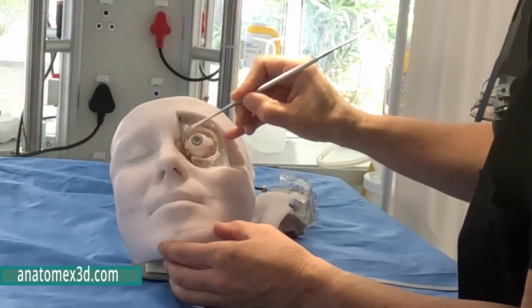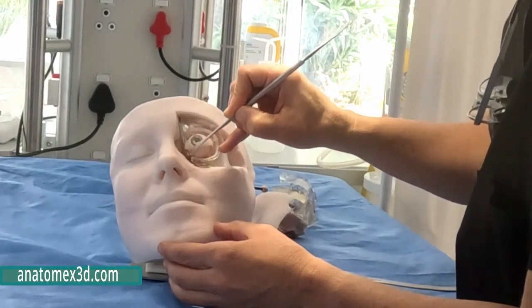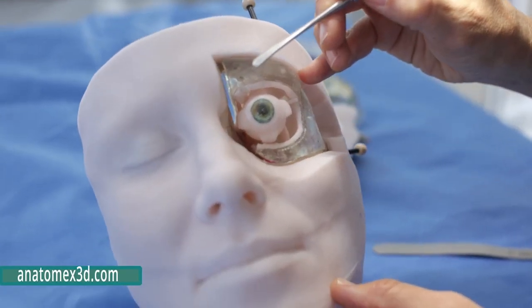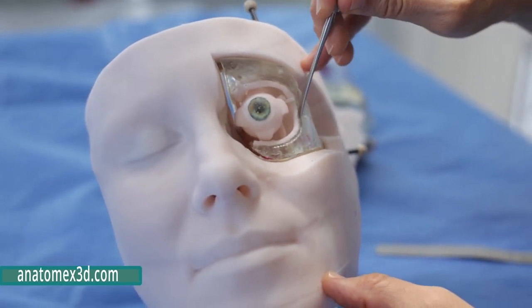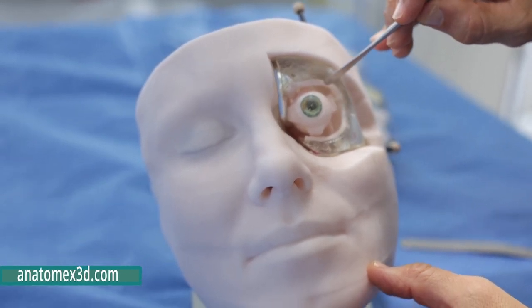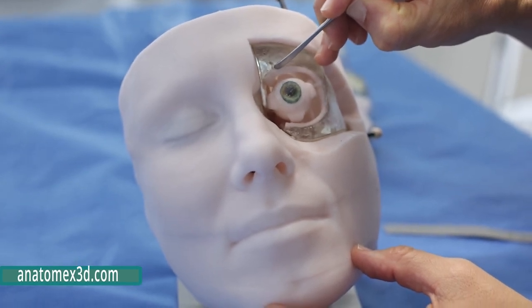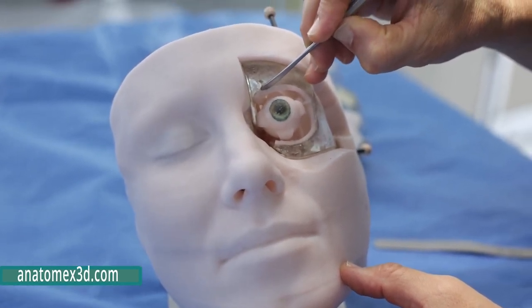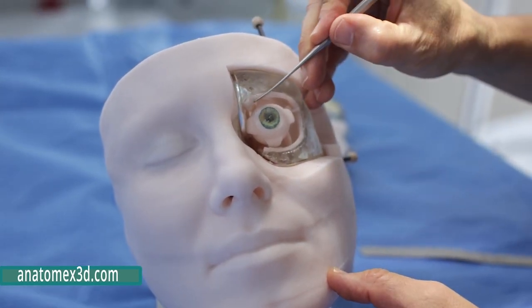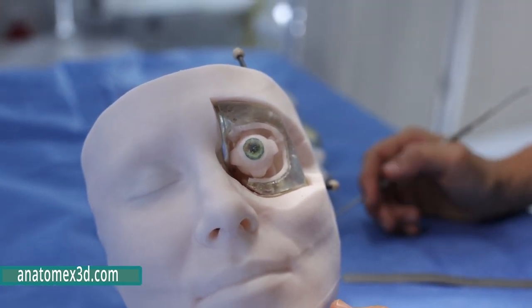And that's really important for people to understand, that when we look at the medial corridor, we work between the trochlea and this area at the bottom where your inferior oblique attaches. So there's no real risk of injuring structures if we remain in a subperiosteal plane, because even at the level of the trochlea, if we dissect the tissue off and remain in the subperiosteal plane, we will dislocate the trochlea where it attaches to the periosteum, to the bone, and as long as you place that back into place and suture it, you will not have any damage to the superior oblique.